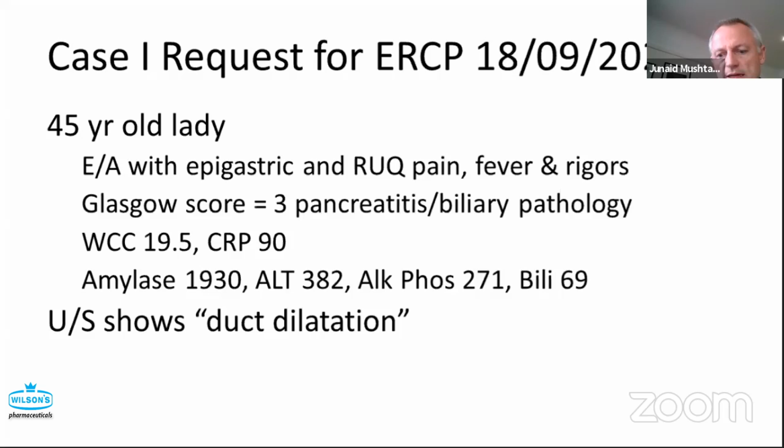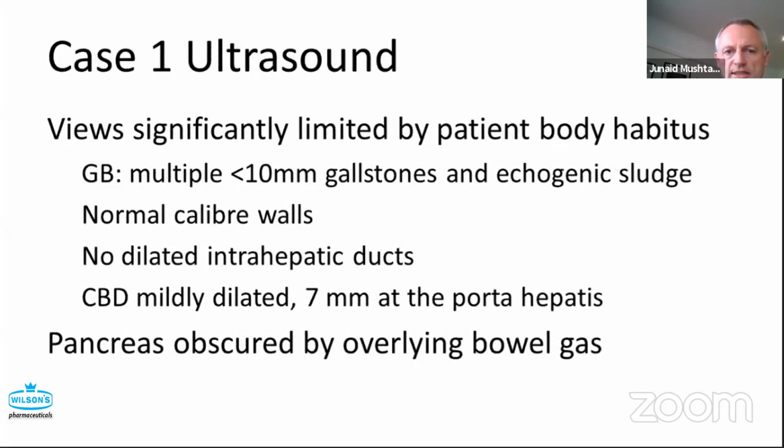So the surgeon came down, and the surgical houseman, and said, is it okay if we put this case on your list, as one of your colleagues has already reviewed the ultrasound? So this is the ultrasound. There are two ways that we can review the ultrasound. One is we look at the report, and the second, which is my preference, is to actually look at the images.